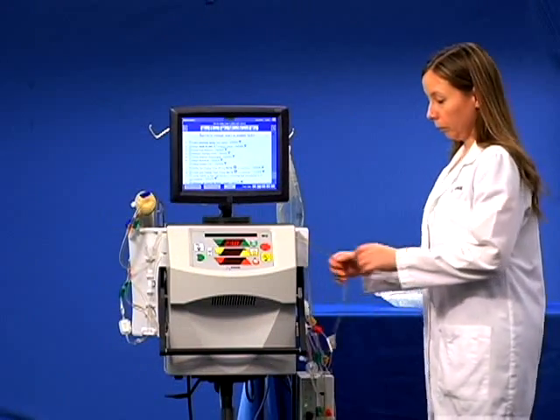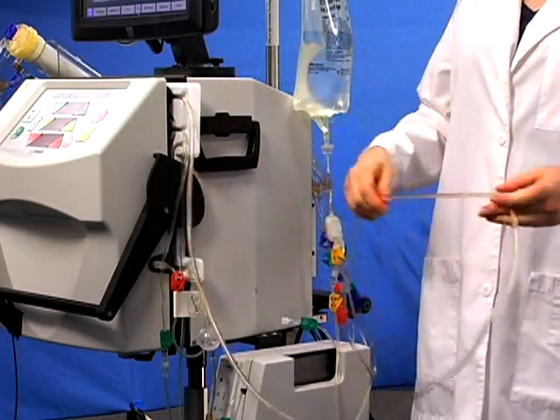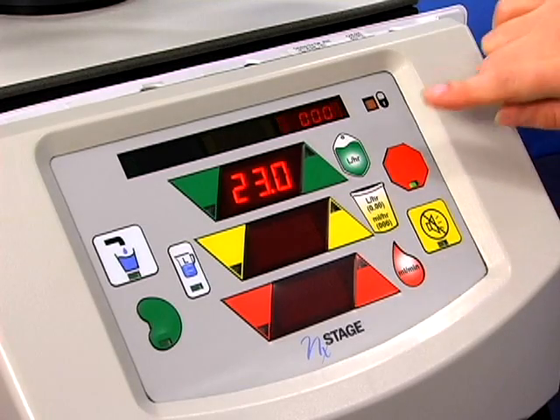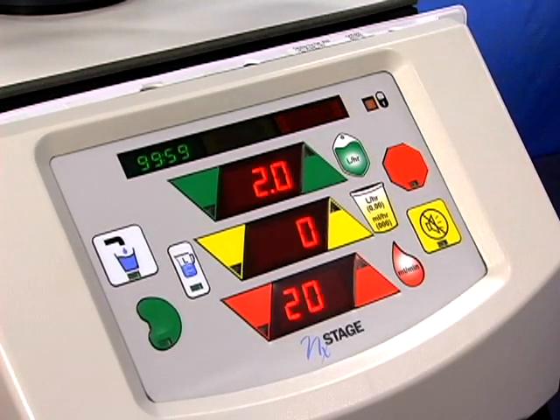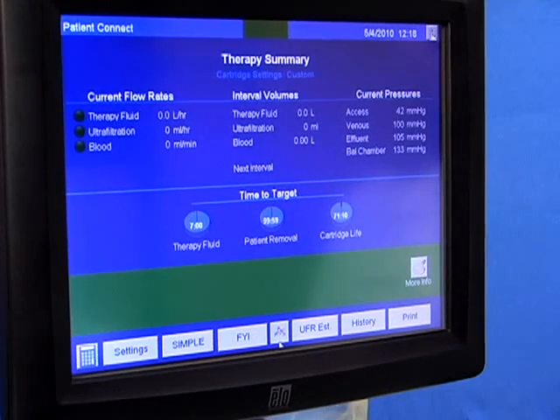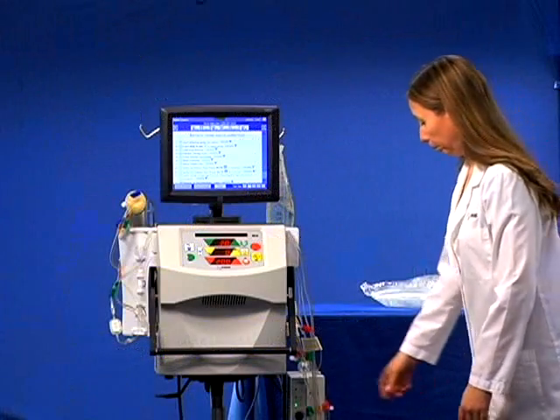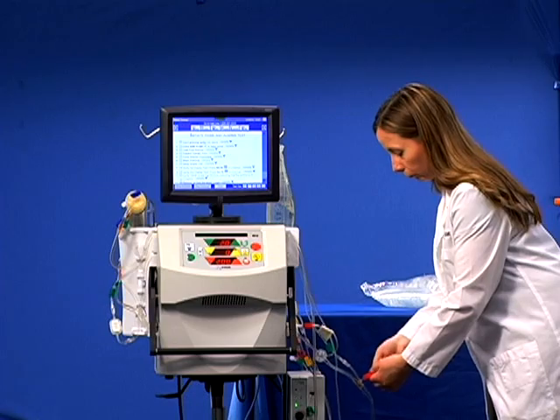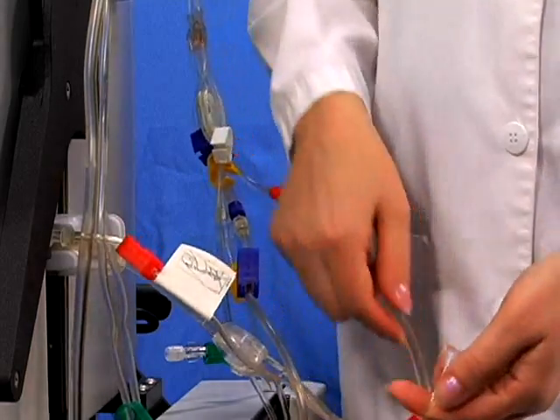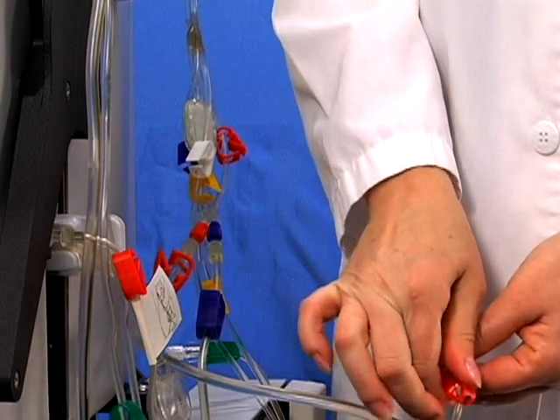Snap the venous patient line all the way back to the saline bag. Press stop. Confirm that your facility's default treatment rates are displayed. Prime is now completed. All pumps are stopped and all safety alarms are armed. You are in patient connect mode. Prime the arterial T's. You have completed the steps in prime.